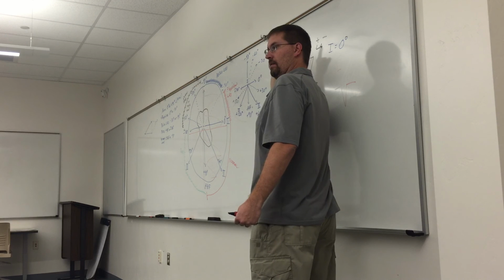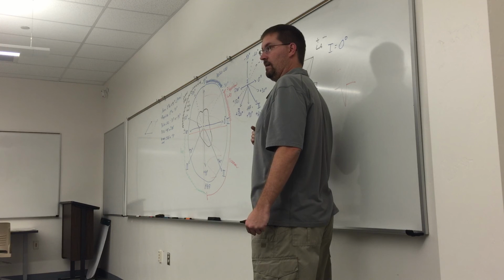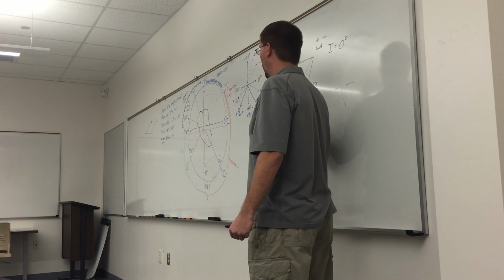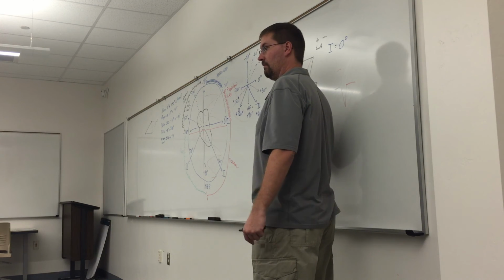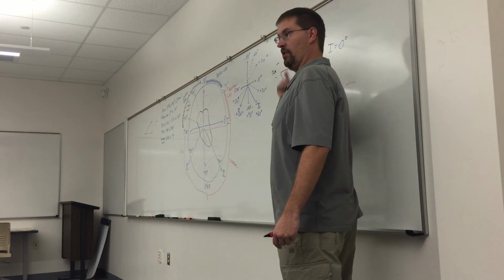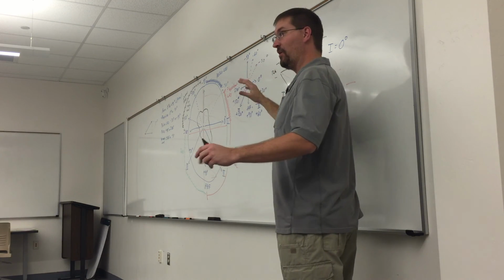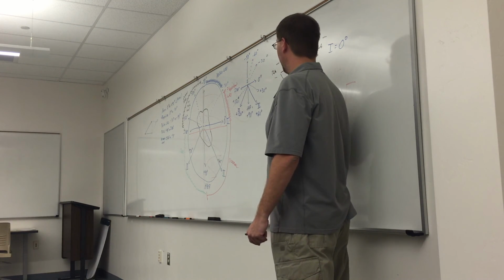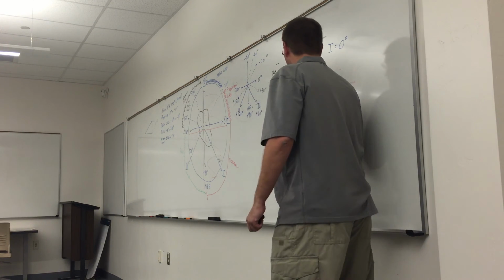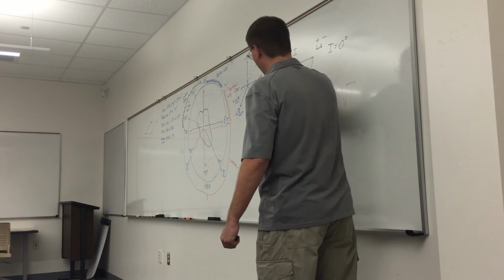Just so you might clear up a little, the QRS has a negative deflection. Instead of saying up and down on the QRS, if the QRS is negative, because when you say down, I think everyone was like, oh, it's going down here. Okay, negative deflection. Okay, it's moving toward the negative electrode. Are you guys cool with that? Is everybody on the same page? Okay, cool. So I'll say negative deflection. Does that help? A little bit. So the QRS is deflecting negatively, or away from the normal way that it goes, right?